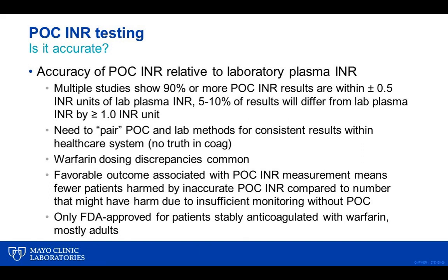Well, many studies show that 90% or more of point-of-care INR results are within half an INR unit of the lab, but 5 to 10% will differ by more than one INR unit. So it isn't perfect, but it's pretty good. There is a need to pair the right point-of-care method to the lab method. Lab methods themselves will differ, so if you use both point-of-care and lab INR to manage the same population of patients, most practices now will want to assess which point-of-care INR method will match my lab.